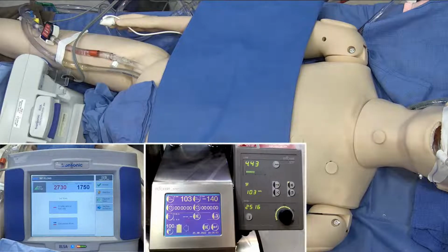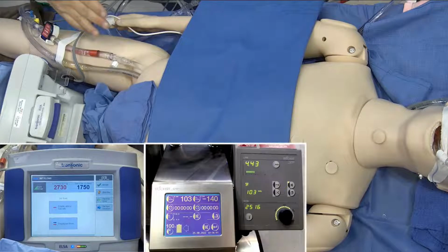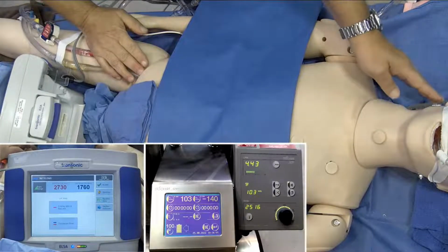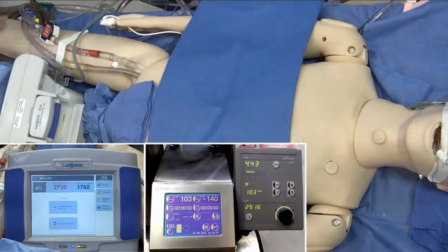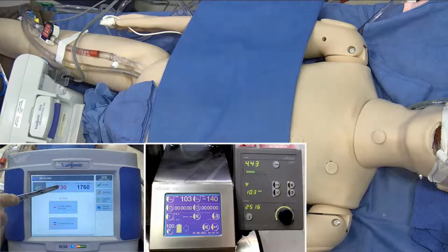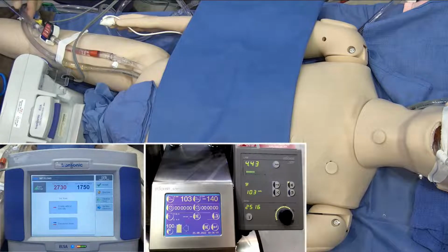That is going to be dependent on a variety of factors. So we're splitting it here and here. 2.7 here, 1.7 here. If I take a clamp and I want to have more flow going here than here, then I must partially occlude this line.